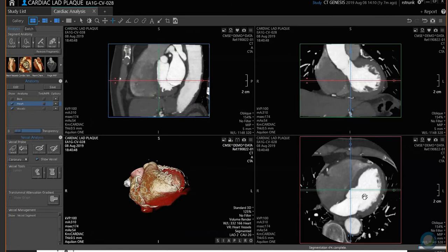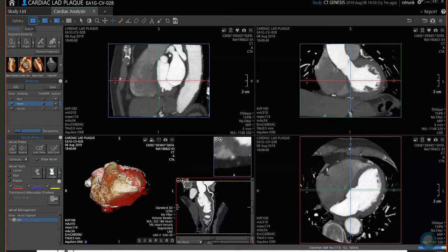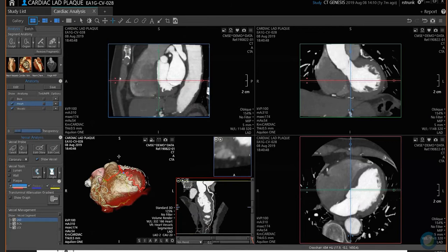The default is to open in this format where you have a sagittal, coronal, and axial image. And then in this fourth viewport, you have the 3D image along with your curved reformat, which I will get into in just a moment.